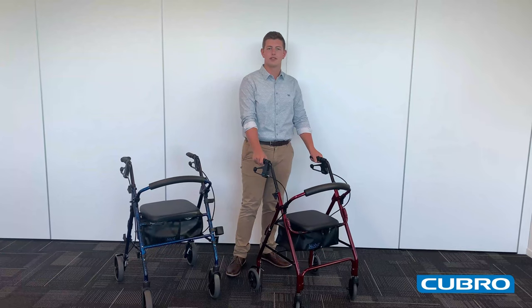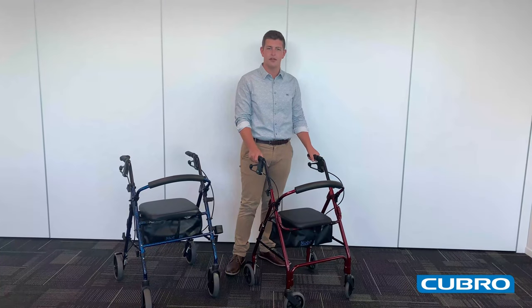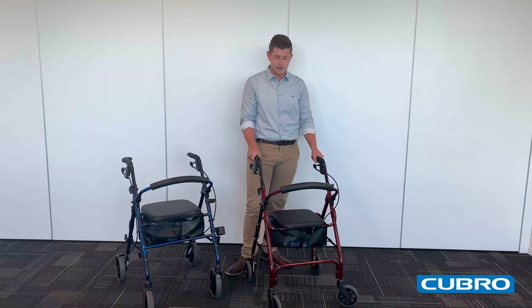Firstly we'll start with the Mobilist Narrow. As the name implies, it is slightly narrower than the rest of the Mobilist family. It still has a really high user weight of 120kg, making it perfect for a wide range of end users.